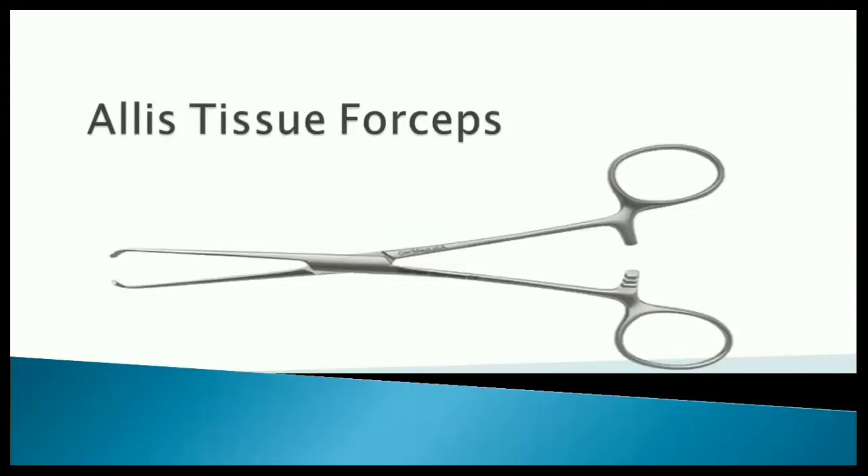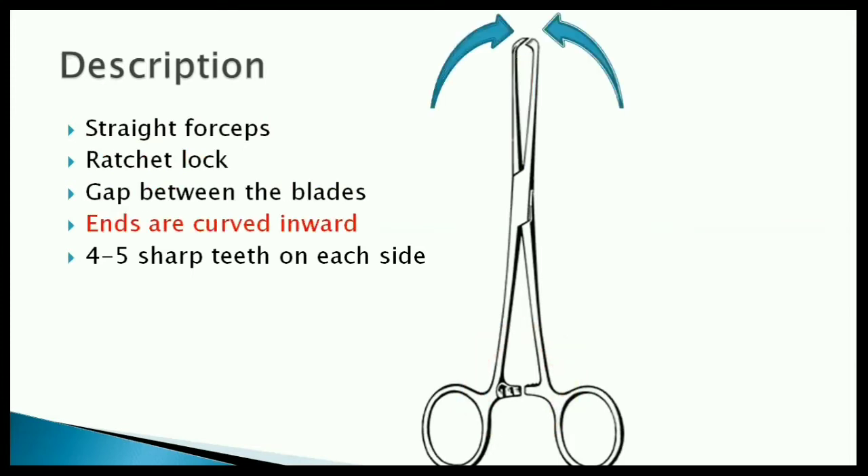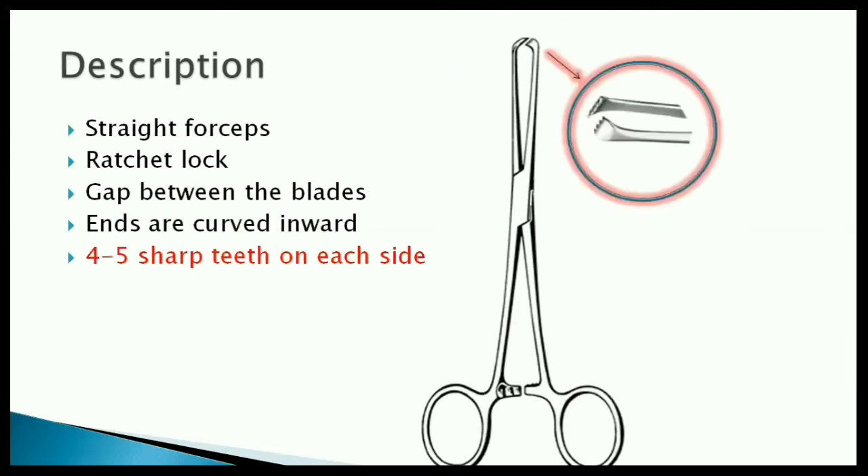Alice Tissue Forceps. It's a long forceps with a ratchet lock at the proximal end. There's a gap between its blades. The blades are curved inward at the ends and have four to five sharp teeth on each side.